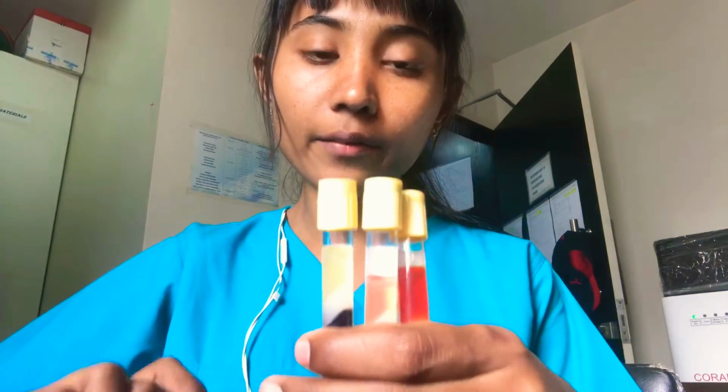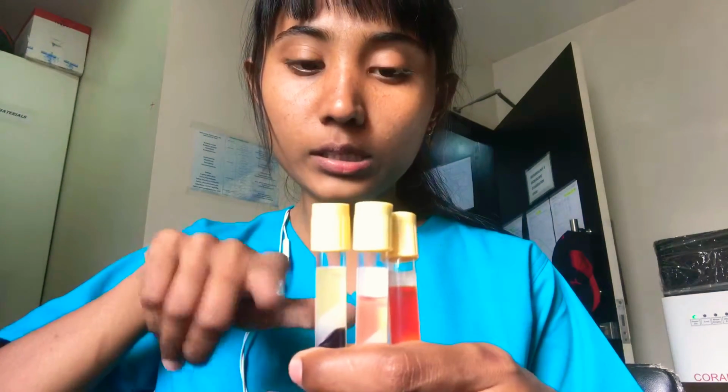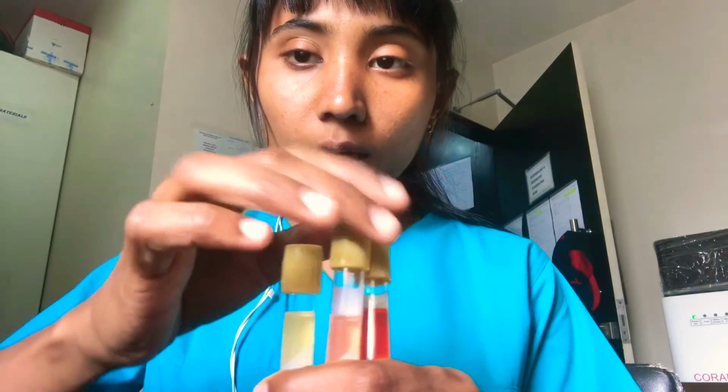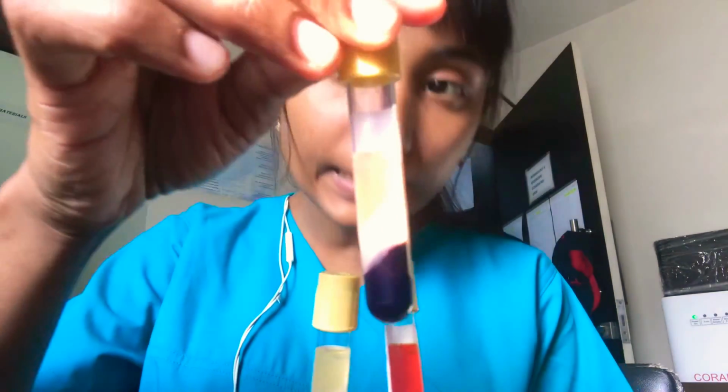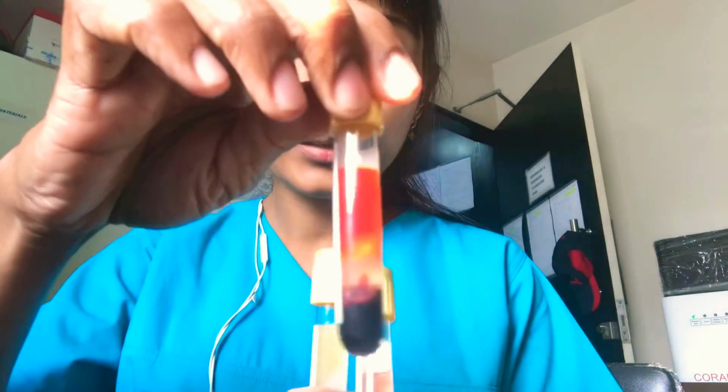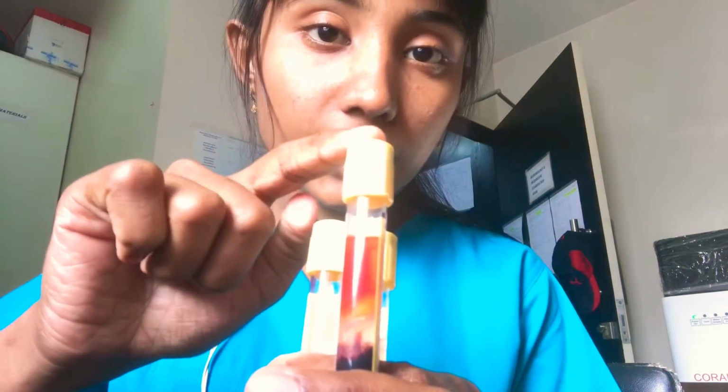So here I have an example of hemolyzed serum. This is a normal serum. This serum is mildly hemolyzed. And this serum is extremely hemolyzed. According to the degree of hemolysis, the changes in serum analytes will vary.